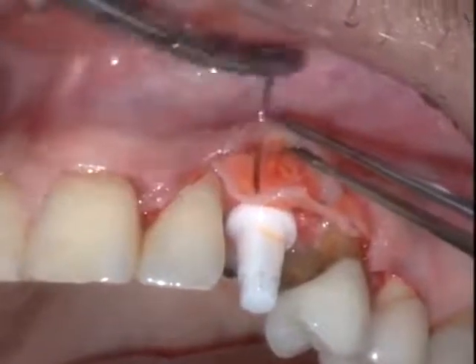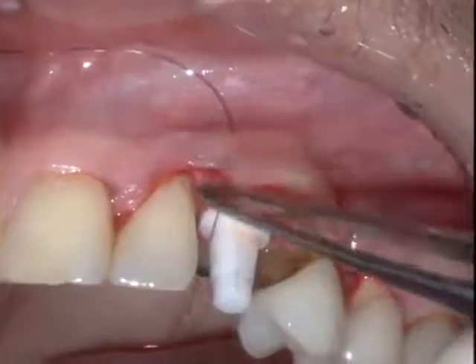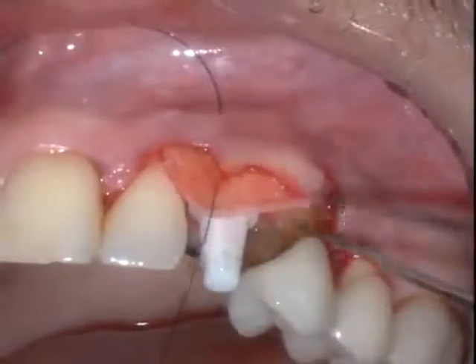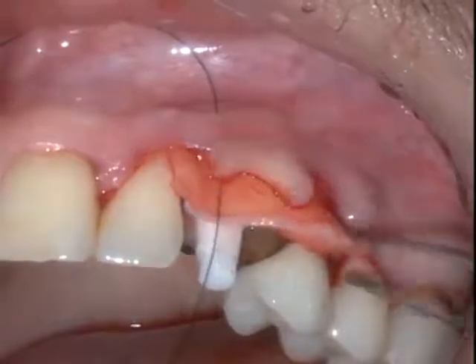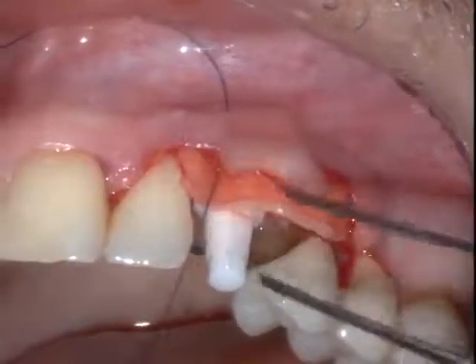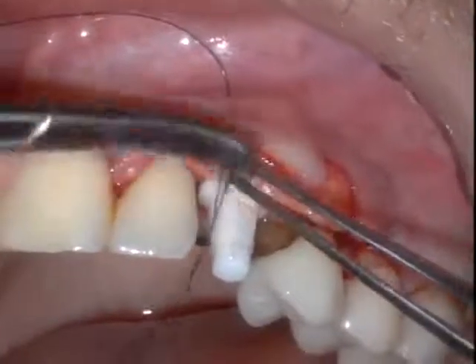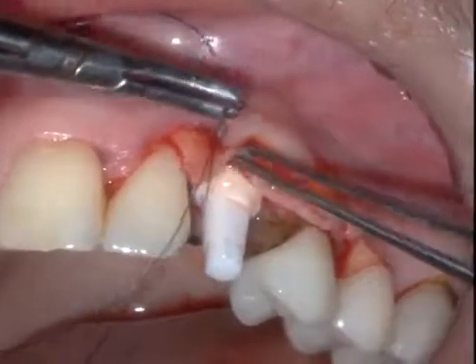The zirconium implant has a shoulder that allows us to prepare it if needed, as well as a length of occlusal area that we are going to reduce after suturing. We're now going to locate the connective tissue graft to allow for augmentation, and we're going to utilize 5-0 nylon sutures.